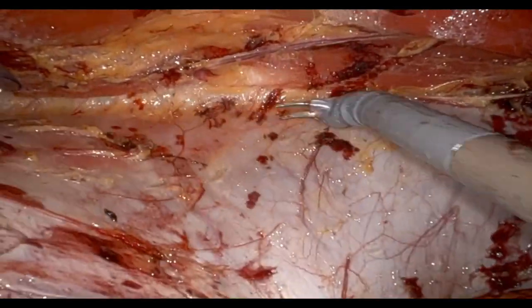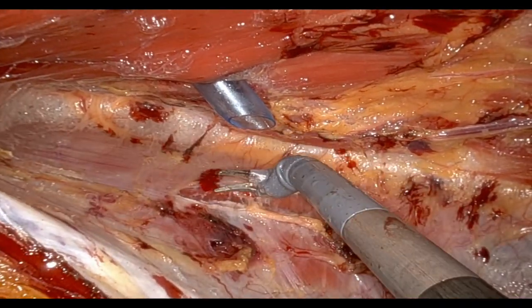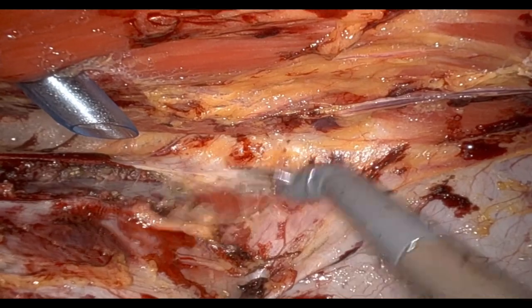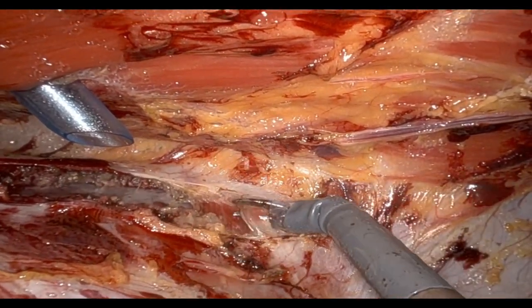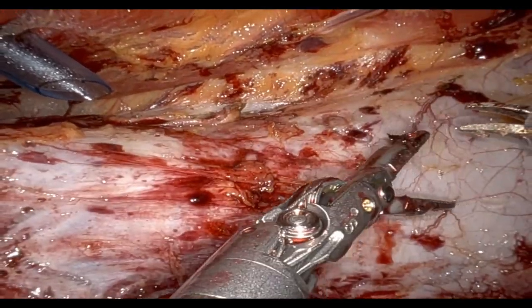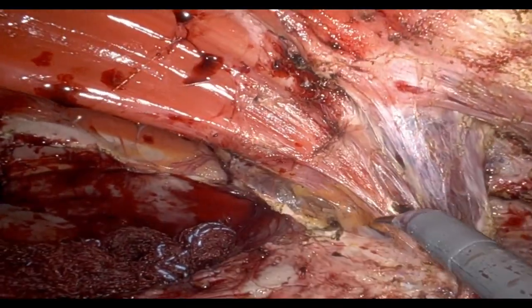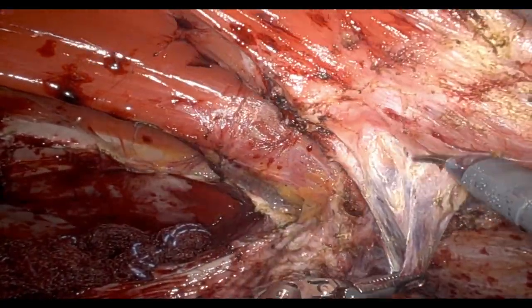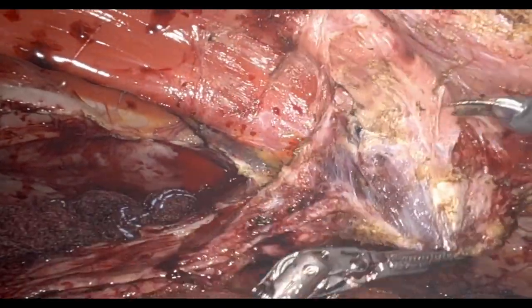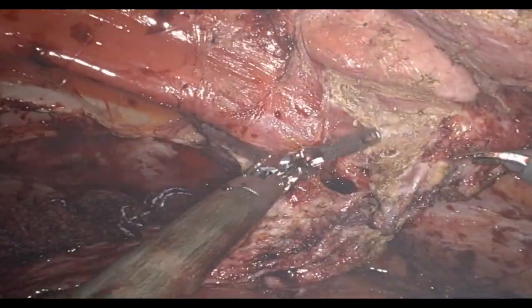For the left-sided TAR, we identify the posterior lamella, incise it, and then take the muscle fibers. As we go cephalad near the preperitoneal fat, I'll go medial to simplify the dissection. The muscle is released and we start working down toward the prior ostomy site. I'm showing that at the ostomy site we were able to recruit some of that hernia sac — it's not much, but these small gains go a long way. It doesn't take much effort, but it does give you extra tissue to minimize potential posterior tension.